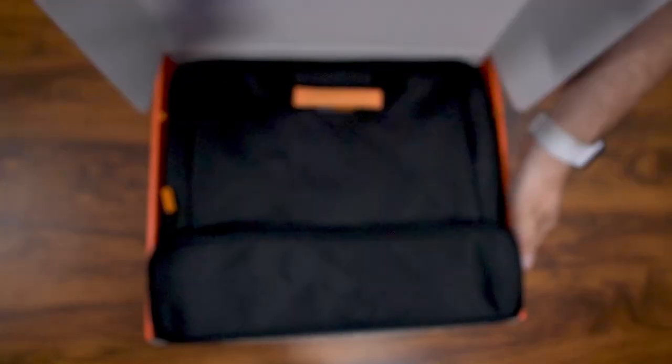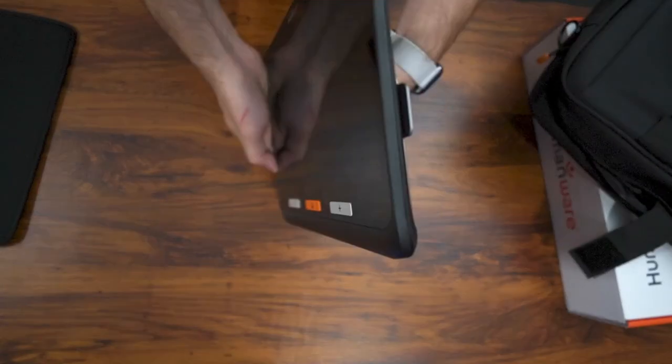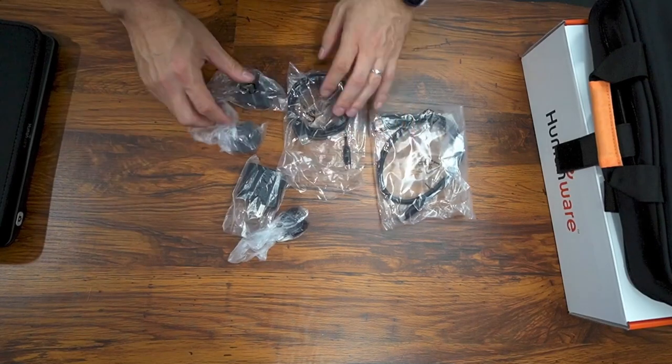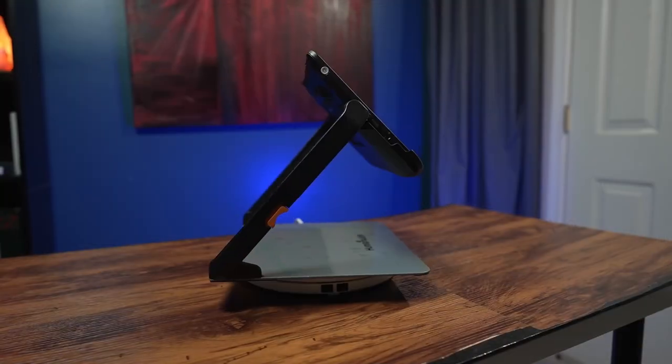In the box, you get a very large carrying bag that comes with a shoulder strap. You get the Explore 12 and a soft material sleeve to hold it. You also get an HDMI cable and a charging cable with plugs from multiple countries.